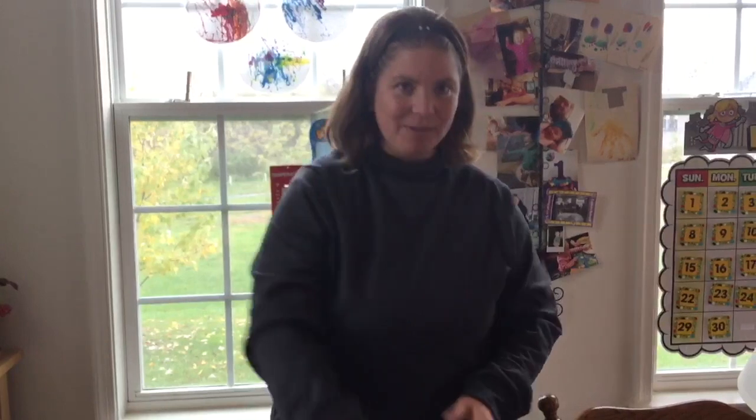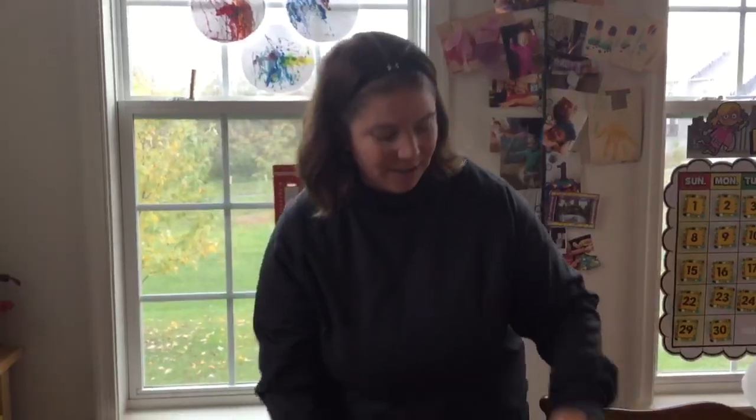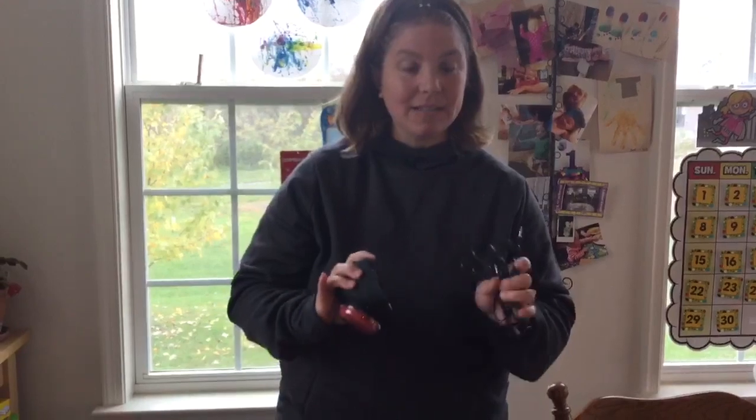Hi everyone, today I'm going to show you how to use your child's step-by-step speech generating device and your power link in the home. You will also need the cord that came with your child's step-by-step in the box. Let's get started.